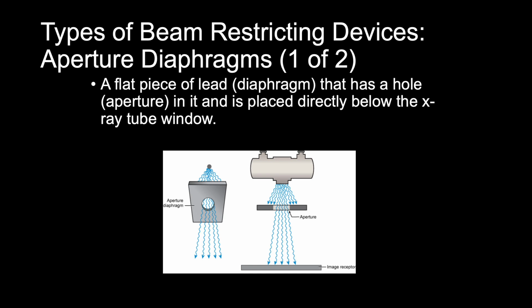It's a diaphragm that can be made by cutting rubberized lead to the size needed, and cutting the center to create the shape and size of the aperture. The aperture's size and shape can be changed when it is made, but the aperture cannot be adjusted from the designed size. The projected field size is not adjustable.